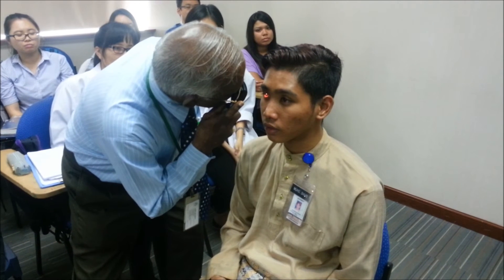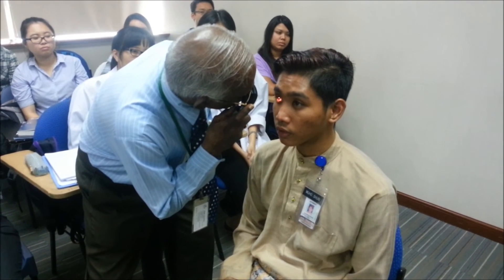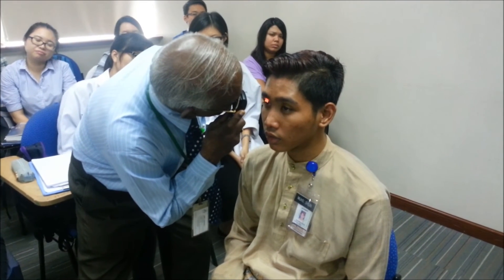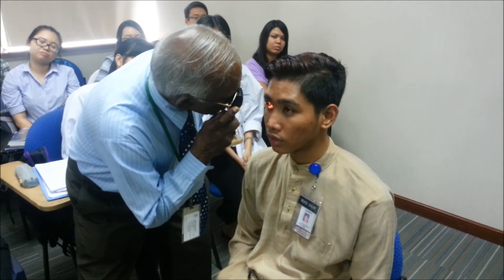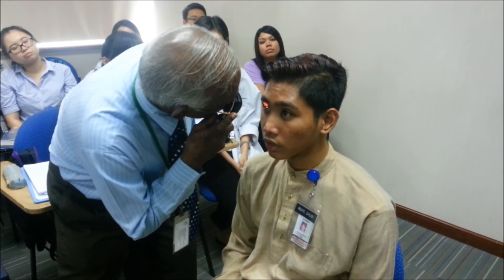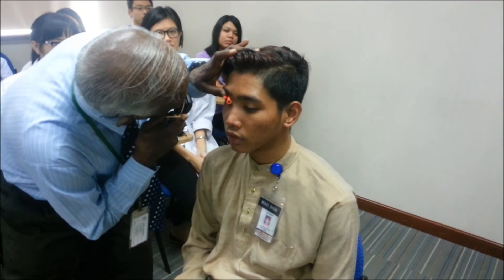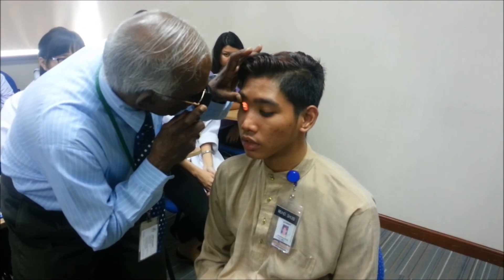A clue to locate the disc is to follow the apex of the V branching of the vessels. The examiner follows the vessels towards the periphery from the disc along the supratemporal, supranasal, infratemporal and infranasal vessels and notes the findings. He asks the patient to look in the direction that needs to be examined, using the thumb to raise the upper lid for better viewing. The macula is finally examined by asking the patient to look directly at the light source of the ophthalmoscope.